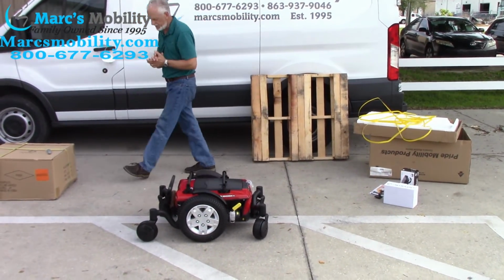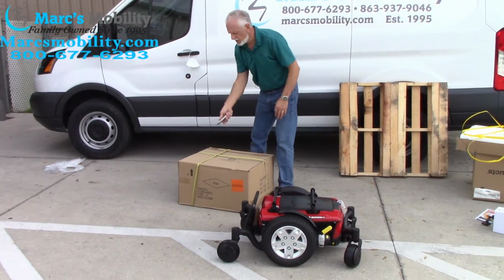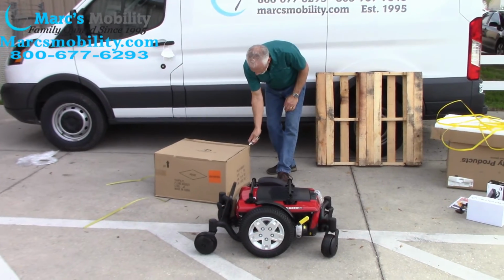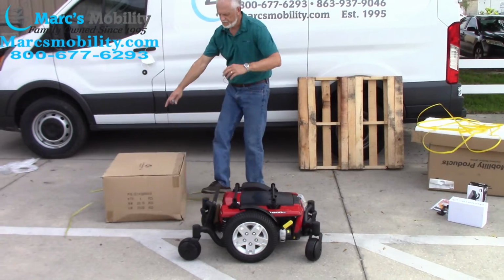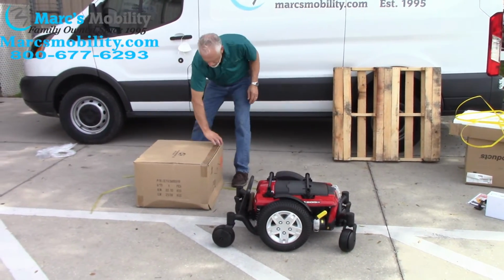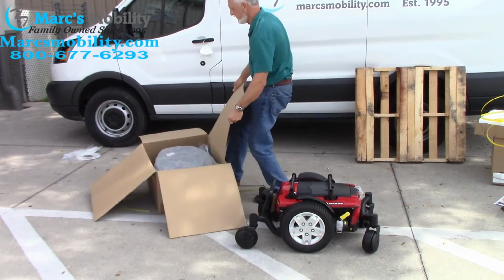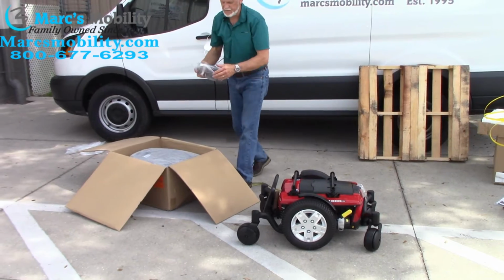Now we're going to go to the seat. So we're back to the seat again. Use your cutter, cut away from you. Never towards you. Cut the plastic here so the top opens up. I'm going to put my knife down. Gonna open this up. Now you've got your seat in here and you have your headrest. Take your headrest out.